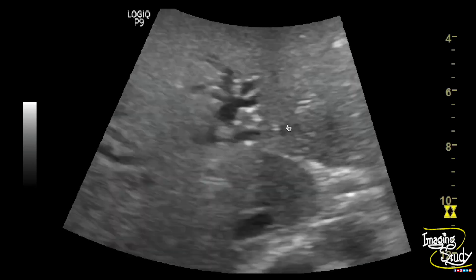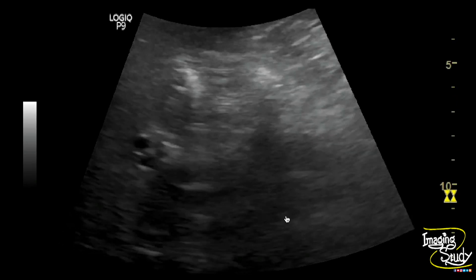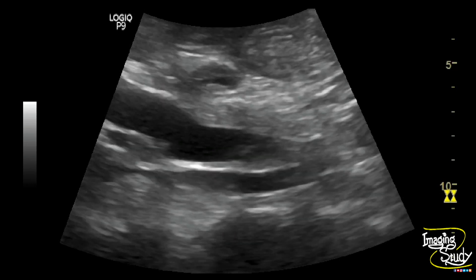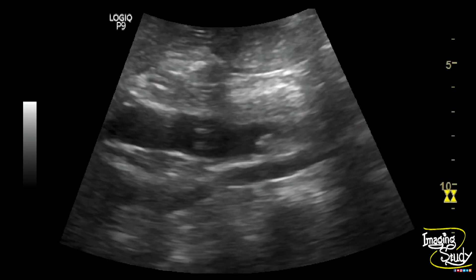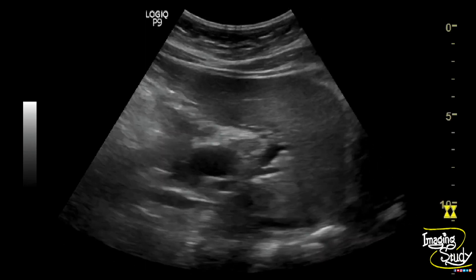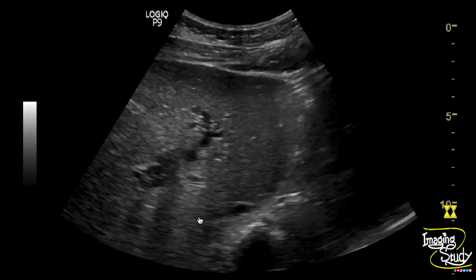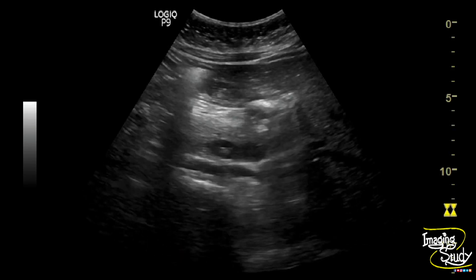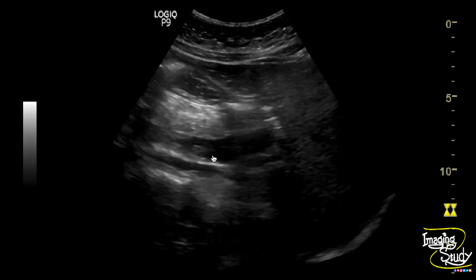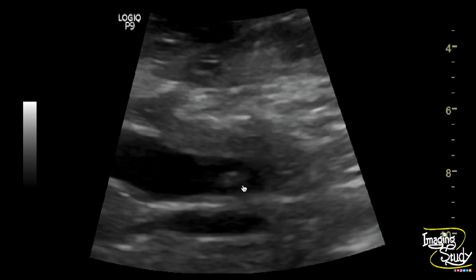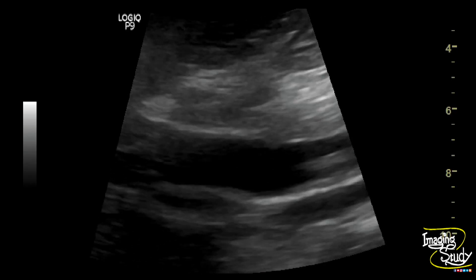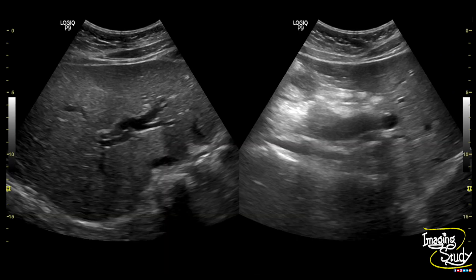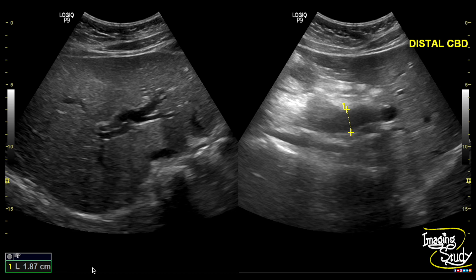Here's the dilated intrahepatic biliary tree. And this is the stone — you can see it here quite well. Now again the magnified image, and here is the stone within the distal common bile duct, indicating choledocholithiasis. You can see the dilated intrahepatic biliary tree and the dilated common bile duct. You can see the distal part is obscured due to duodenal gas shadow. The common bile duct was around 18 mm in diameter, which is quite dilated.